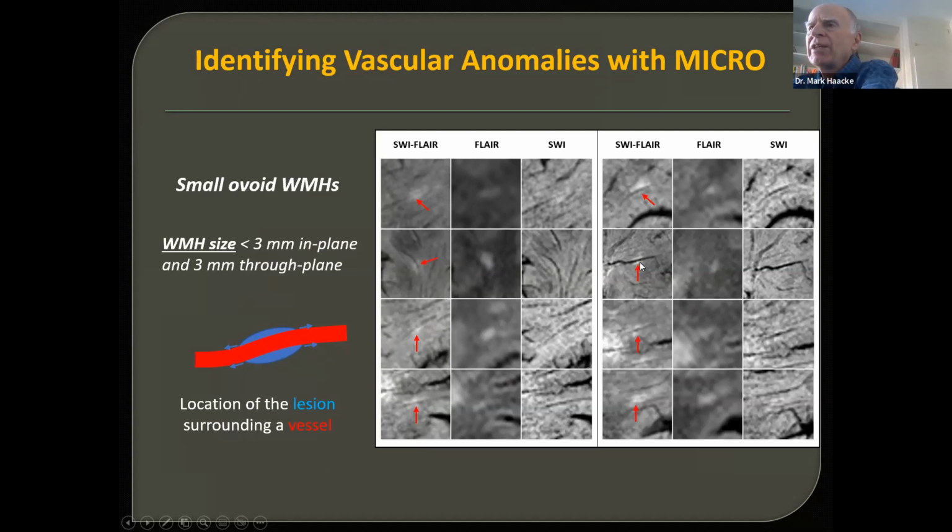And we're now seeing this where we never saw these before with conventional imaging. And I do have one case of an individual who had been imaged over 15 years, who starts off with a small enhancement like this. And then over the next 5 years, that inflammation just grows all along here. 5 years later, it's a much, much bigger lesion, and it has the central vein sign.